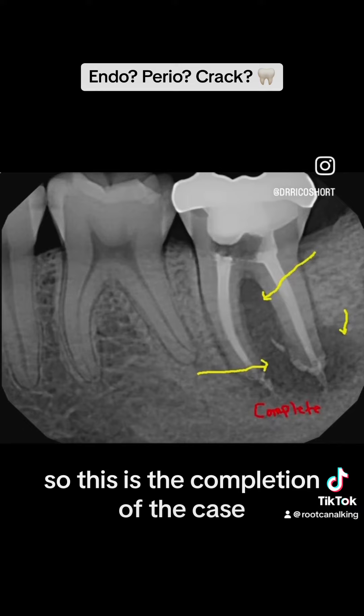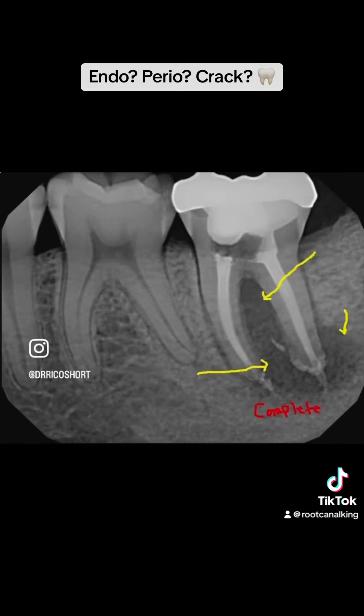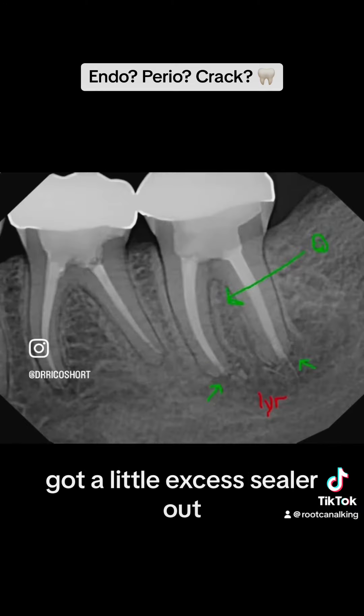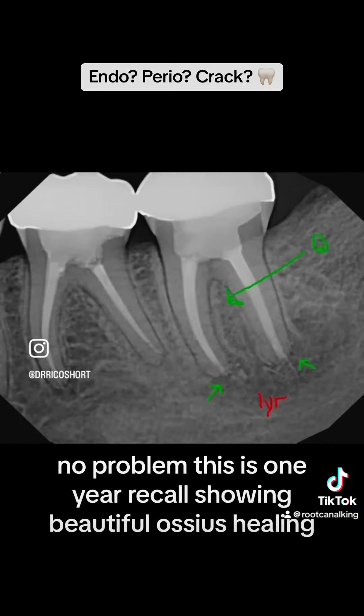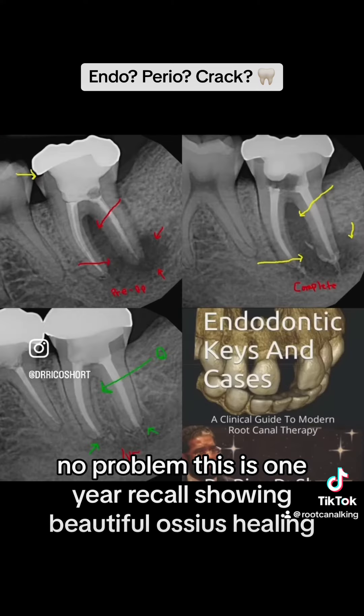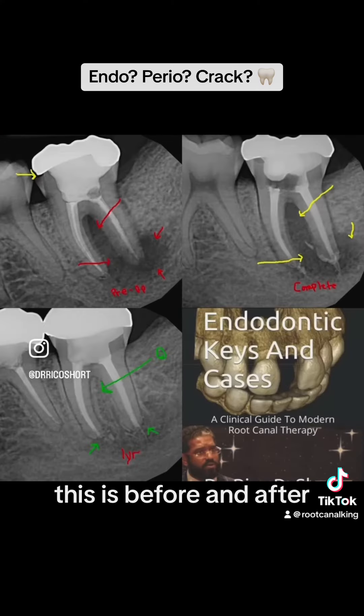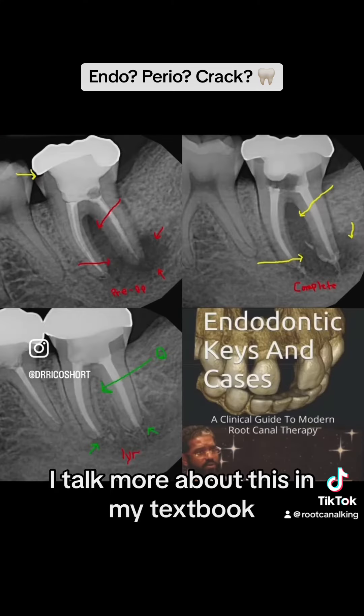This is the completion of the case. We got a little excess sealer out — no problem. This is the one-year recall showing beautiful osseous healing. This is the before and after. I'll talk more about this in my textbook.